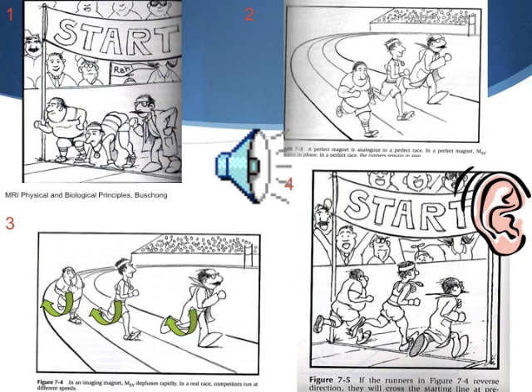When you hit it with a 180-degree rephasing pulse, you make them do an about face on the track. And so they haven't changed in speed. The slow one is still slow, the fast one's still fast, the fastest one is still fastest. But as they have done their 180 and they're coming back around the track the opposite direction, eventually, even if those speeds didn't change, they're all going to line up at one point.